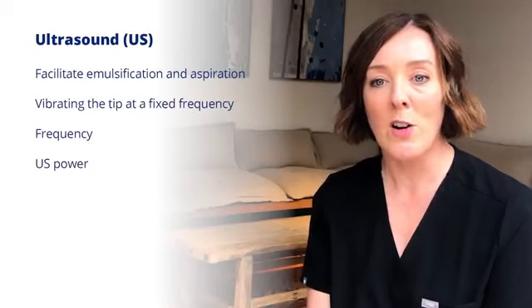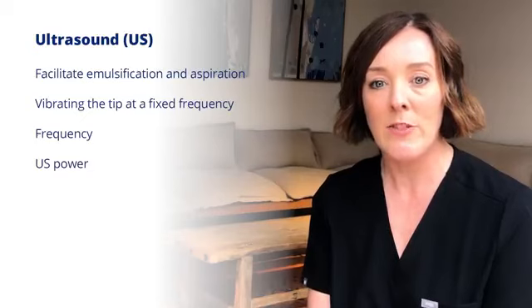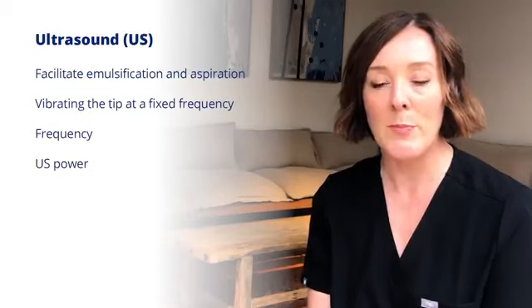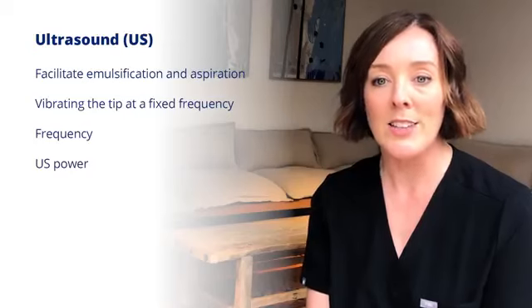Foot pedal control of ultrasound power is usually linear. Depressing your foot further increases the ultrasound power by increasing the stroke length, not the frequency. The frequency remains fixed. Too much power increases the heat dissipation and endothelial cell loss. Too little power creates stress on the zonules and capsule.